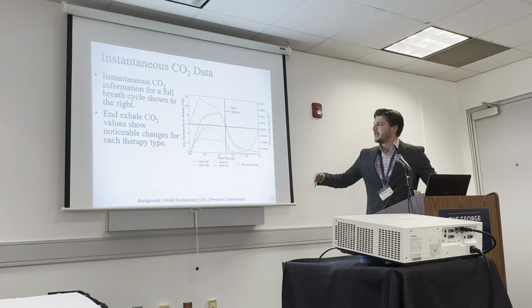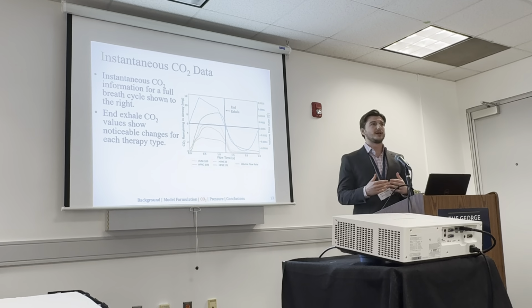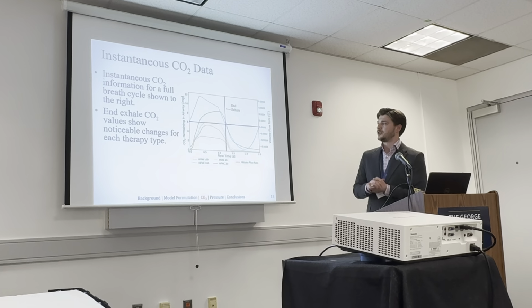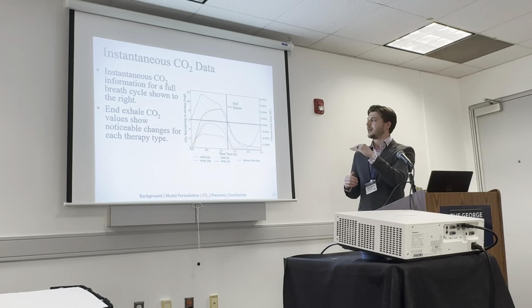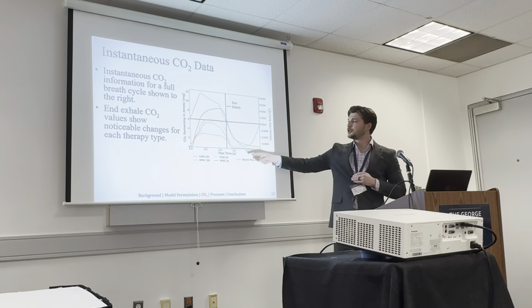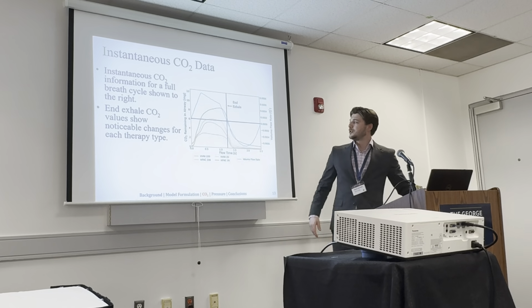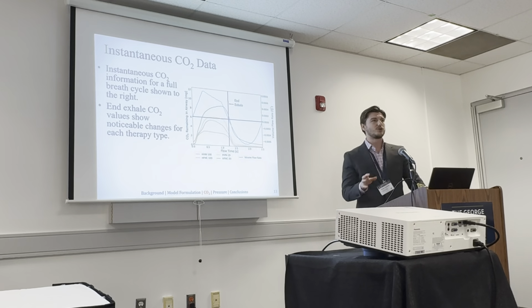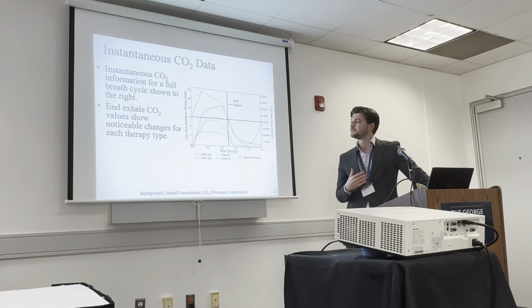You can see that the shape of the curves is pretty similar, even though the HVNI 20 reaches significantly higher maximums. You see this approach to the peak CO2 retained, a little bit of a flat line, and then they drop off, and especially the HVNI 20 sharply drops off as the volume flow rate is decreasing. By end exhale, there's not too much distinction between the two, maybe about 1 milligram of CO2 additionally retained because of the closing mouth.